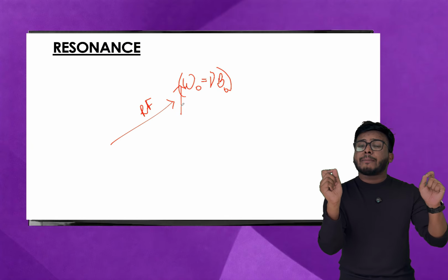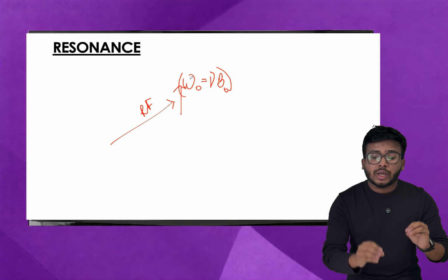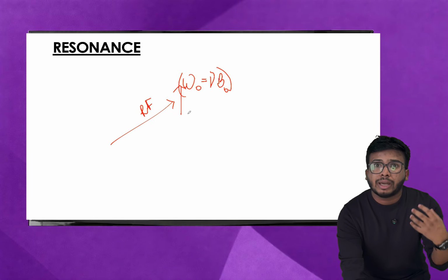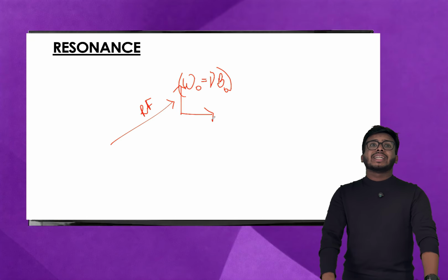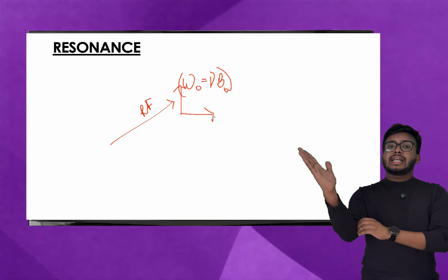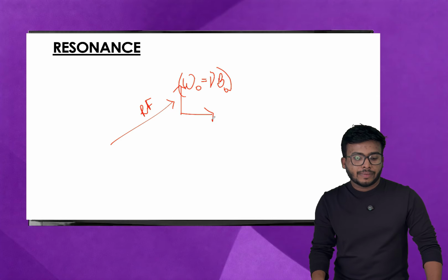So when the protons get a frequency matching the precessional frequency, omega equal to gamma B naught, by the radio frequency pulse, they will flip into transverse magnetization. Now they have the energy to flip.